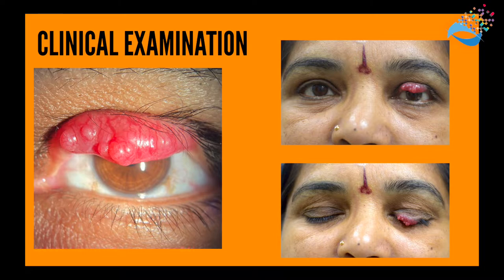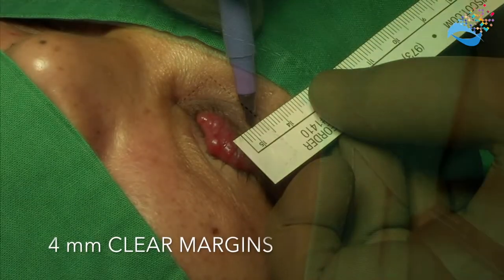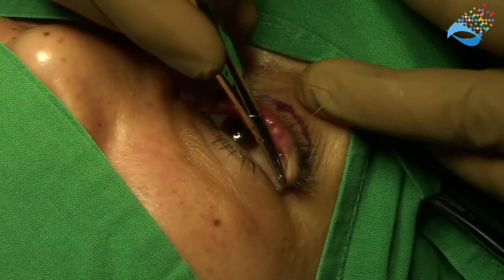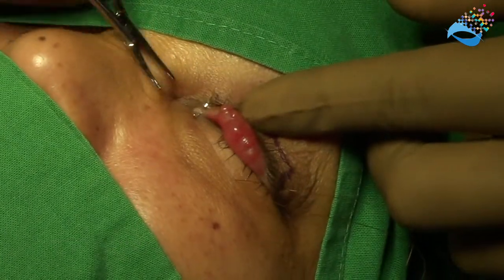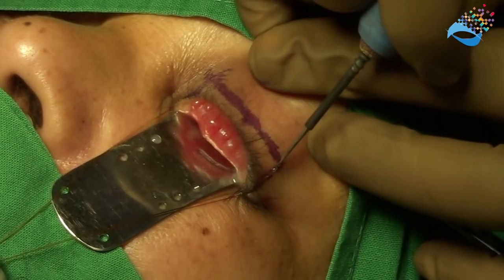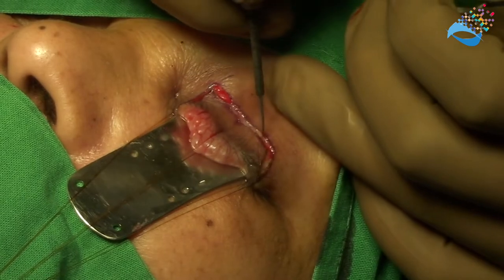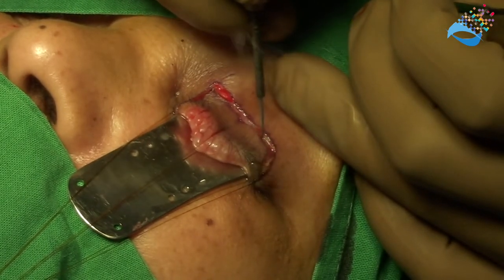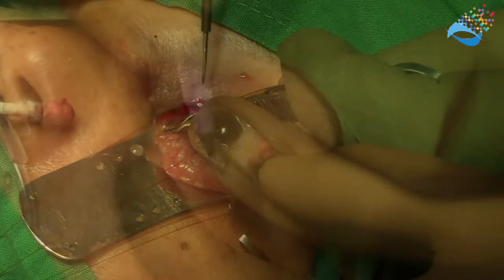In this video we describe the case of a 45-year-old female with a left upper eyelid mass. Four millimeters of clear margin is measured and marked. Traction sutures are then taken to keep the lid stretched. Along the markings, an incision is made either with a blade or with a radiofrequency cutter. This is a full-thickness incision, and the mass is excised, thereby creating the colobomatous defect.